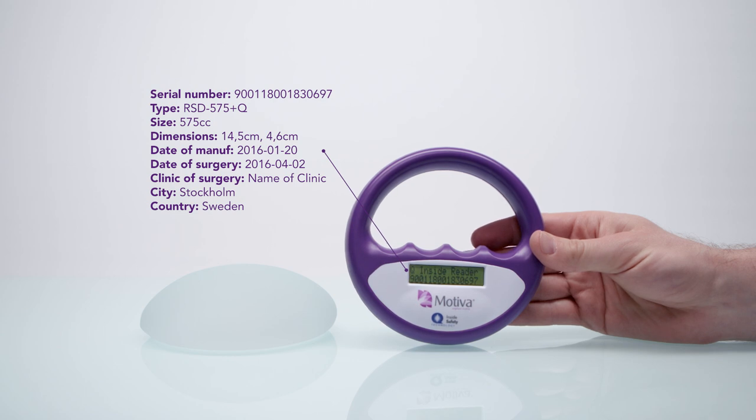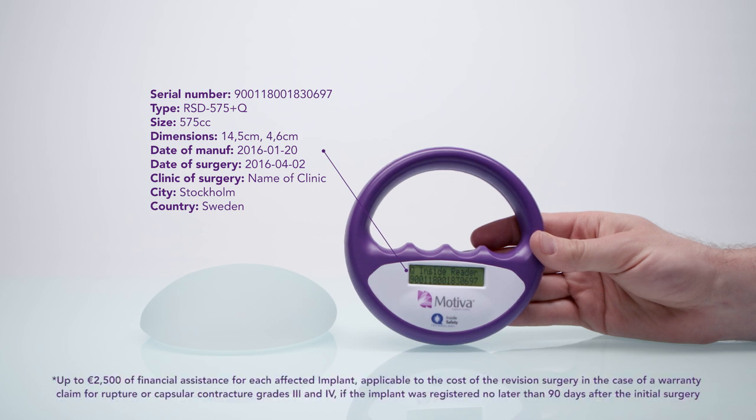Patients also have the option to choose an extended warranty that provides financial compensation for a possible revision surgery, if the implants are registered within 90 days of the initial surgery. You can learn more about our guarantees and how to register your implants at motivaimplants.com or by consulting your surgeon.